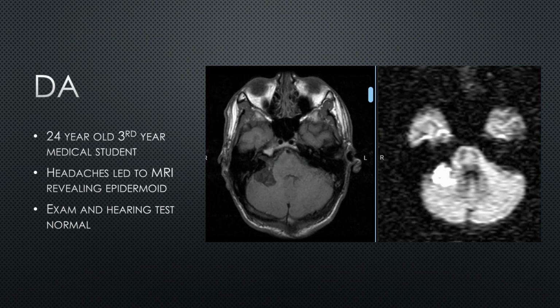The first case is a 24-year-old third-year medical student. He was having headaches, led to an MRI, which led to the images that you see, diagnosed as an epidermoid. I'm not going to trick you guys on imaging. Basically, on this one, what you see is what you get.